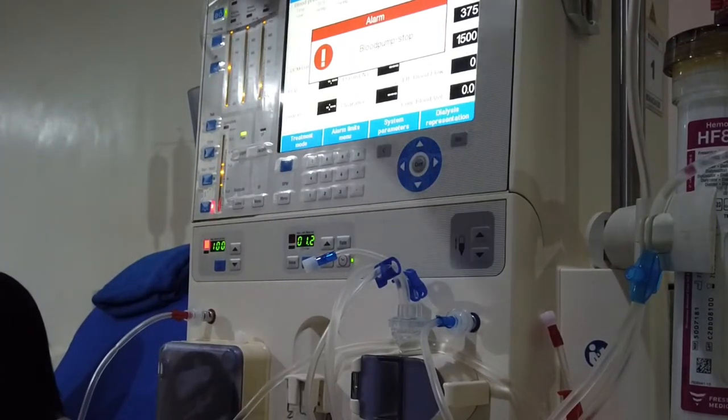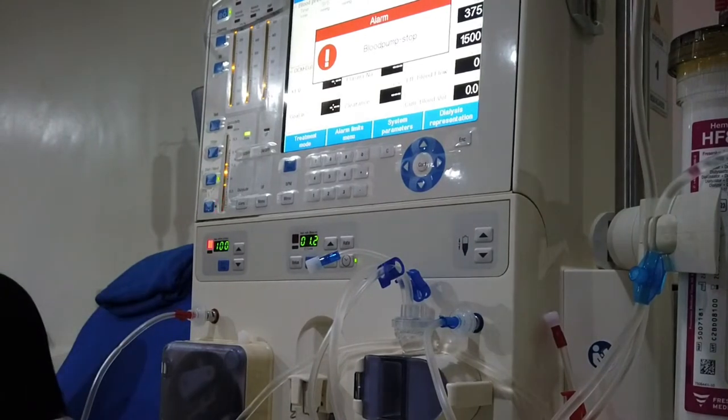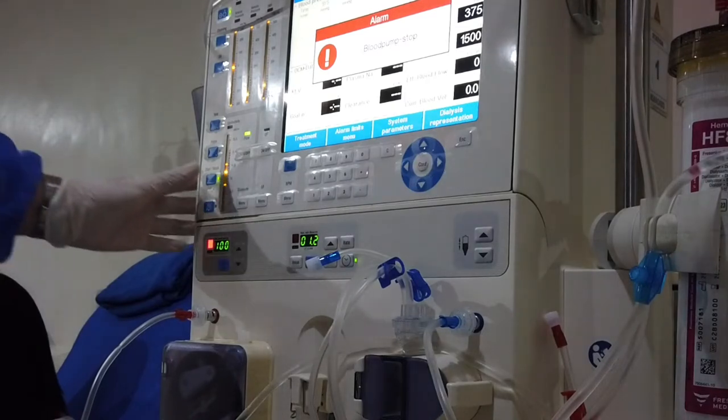Connect the arterial line to the patient's arterial needle, then open both clamps — the needle side and the arterial line. The machine will usually alarm due to blood pump stop. Click the reset button, then start the blood pump.